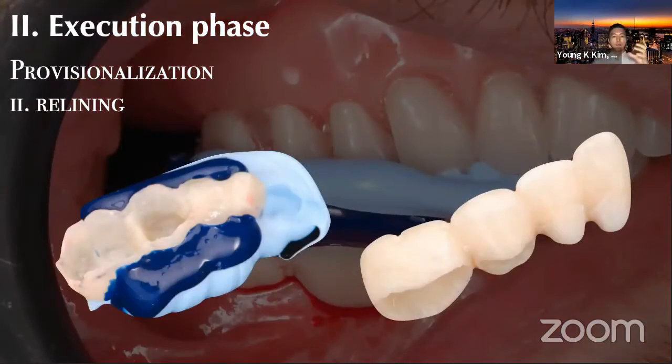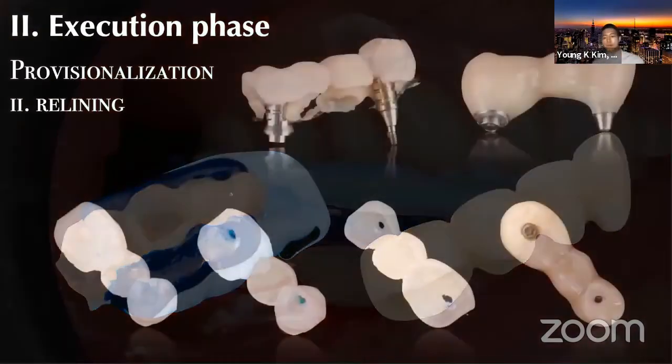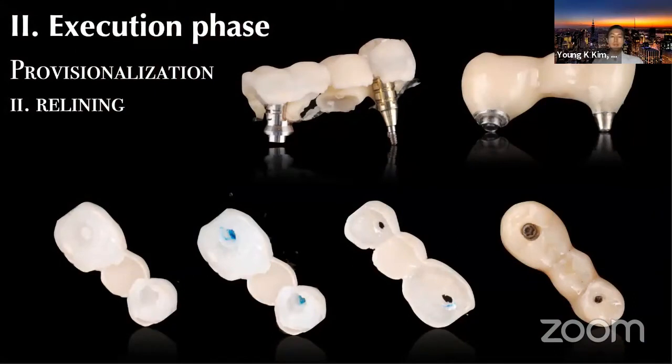And the critical part for the temporary, as you all may well know, is clear margins, ovate pontic site, highly polished. So we're sort of stimulating the epithelial tissue with the desmosomes and the embrasure spaces on the ovate pontic sites as well. So those are kinds of things that you want to put into your checklist when you're doing the temporary relining. And this is just a temp shell relining technique with implants.